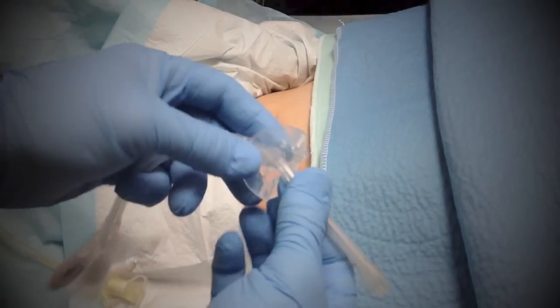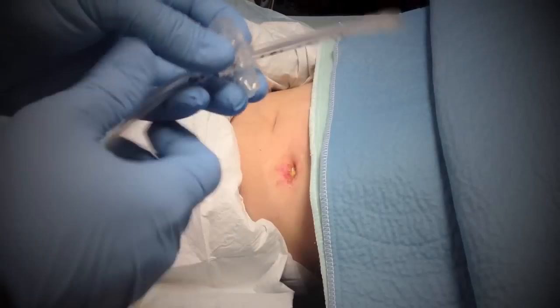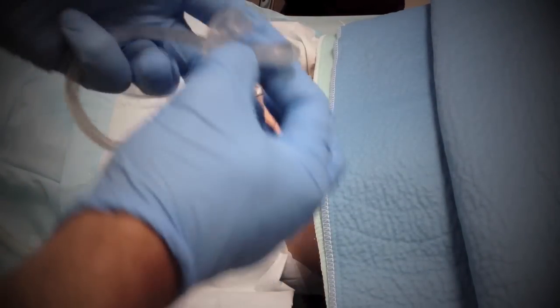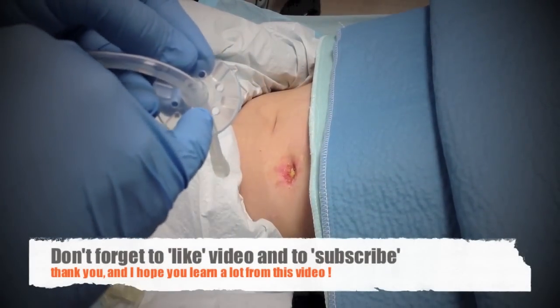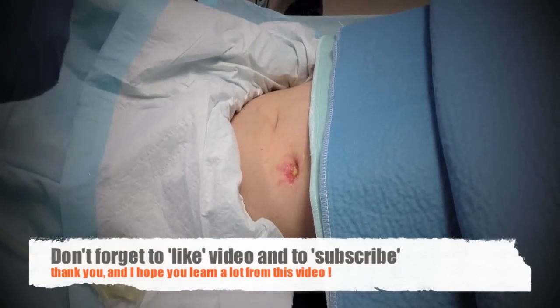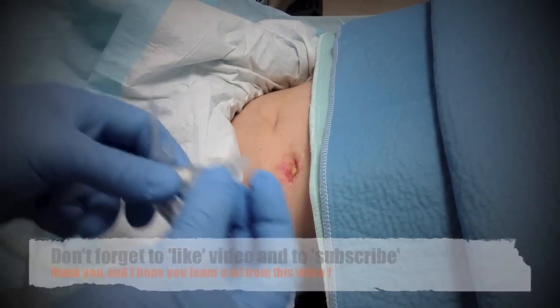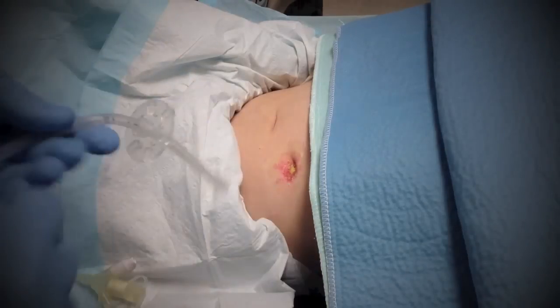This little part moves around, and once we inflate the balloon and pull back, that creates a seal. When it's brand new, it has little holes on it that are used to put sutures through to hold it to the skin until the stoma has matured enough. I always go ahead and lock this up so you don't get gastric juices coming through the tube while you're doing the procedure.